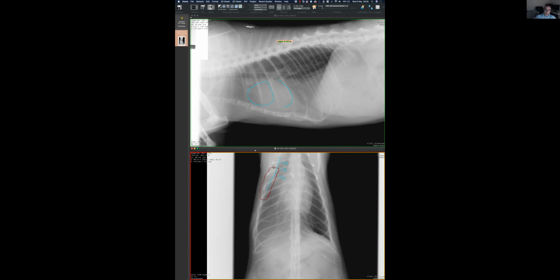I want to bring these two findings together: you brought the separation, and we agree that it's pleural, and then you brought the inability to see the contour of the heart. I'm going to say that they go together, so there is no conflict there. Makes sense? If you have something in the pleural space, it is outside the lung. In the same way that it could separate the lung, it could go against the heart, and then it can blur that contour.